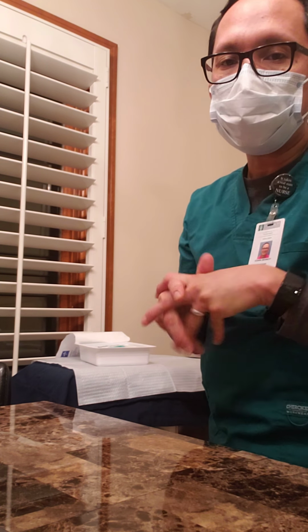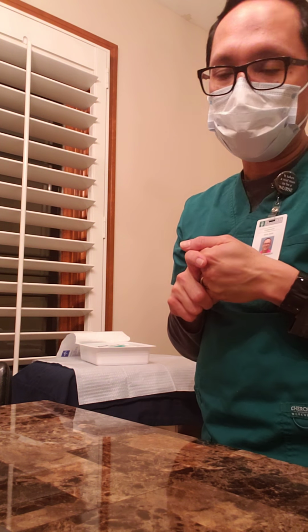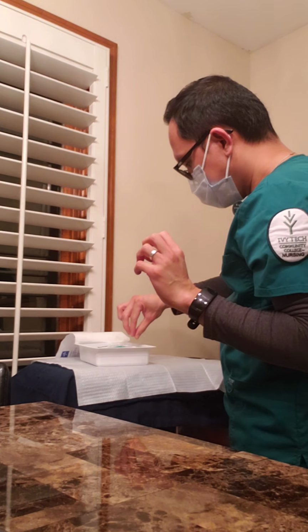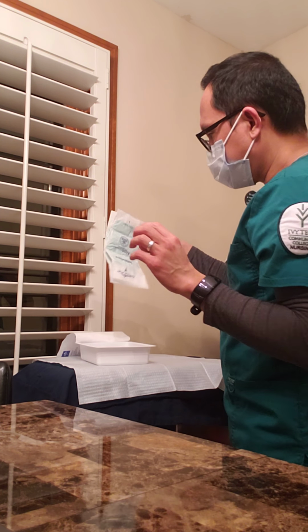At this point in time, I've taken my regular gloves off. I'm going to go ahead and put on my sterile gloves. Just carefully take them out of the sterile kit.